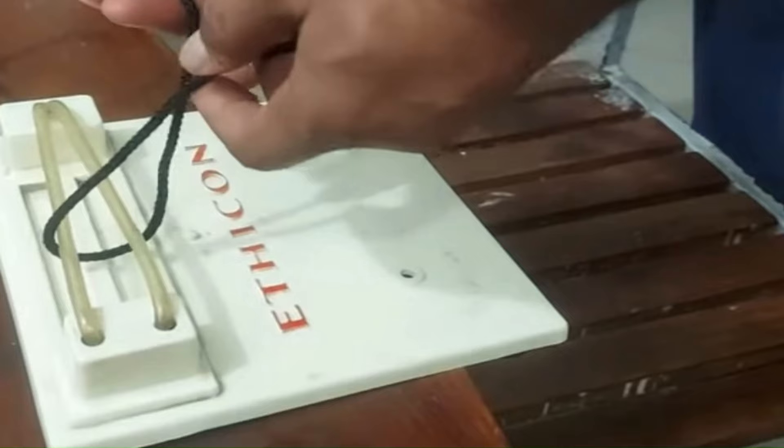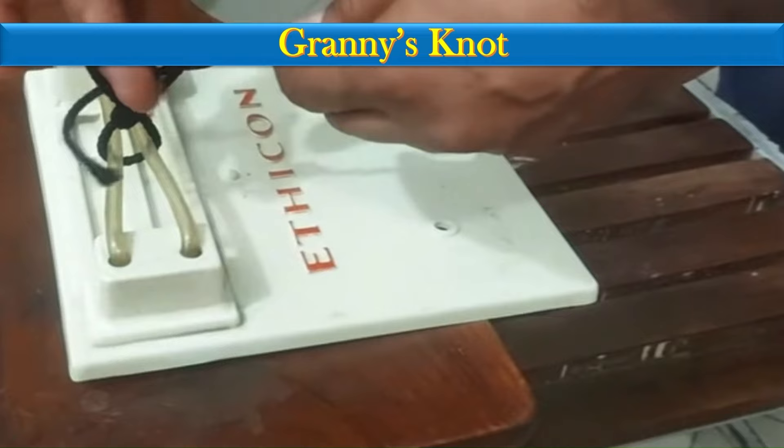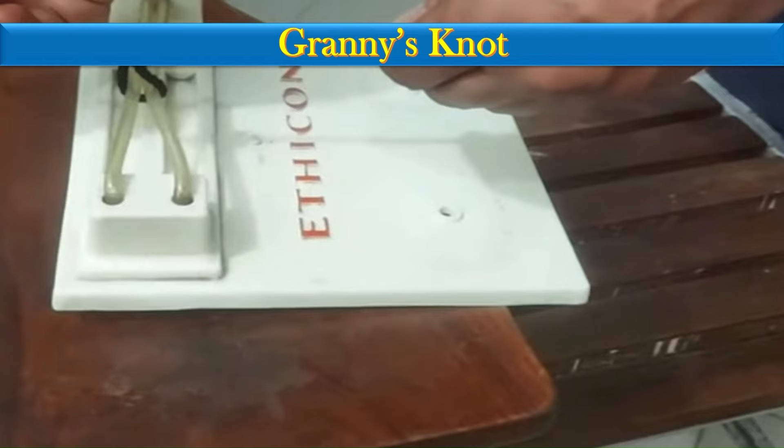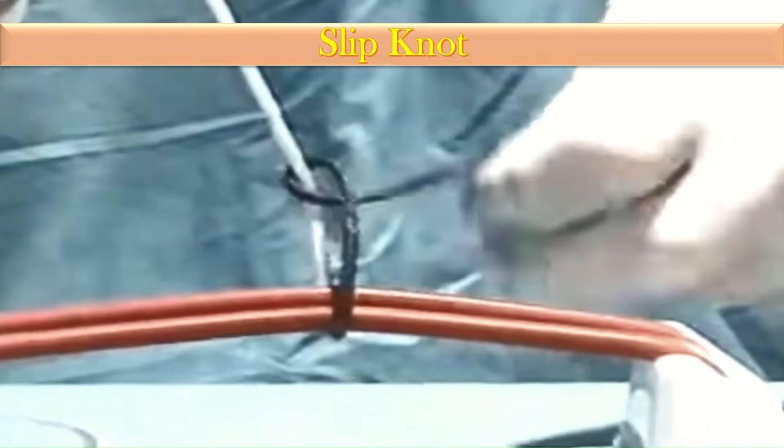The next type of knot is the granny knot. In the granny knot, we overlap the two threads, pass one thread through the other thread's loop, then pass the other thread through the first thread's loop. The ends are pulled and the knot is tightened.